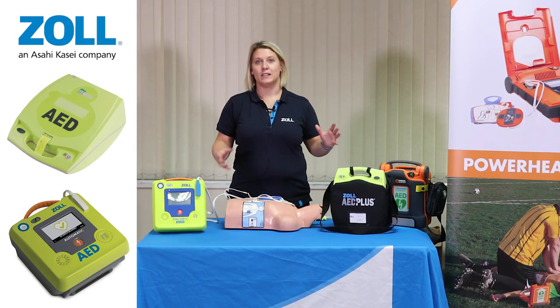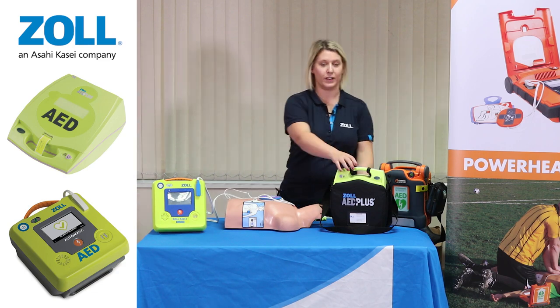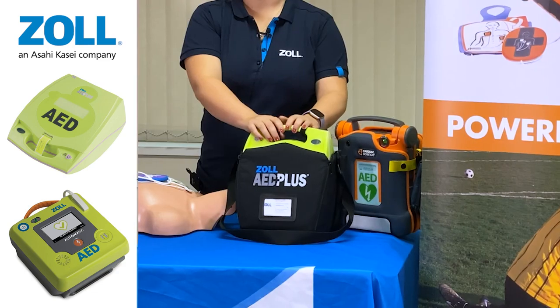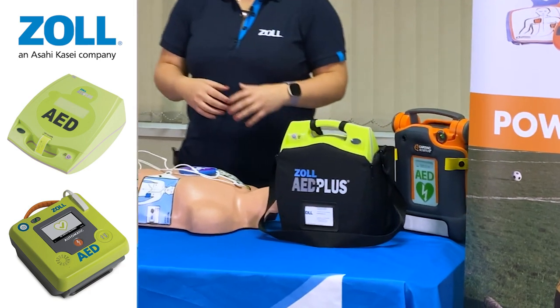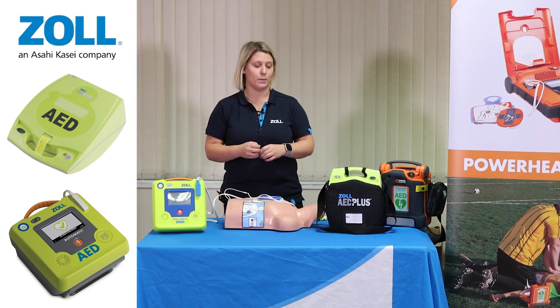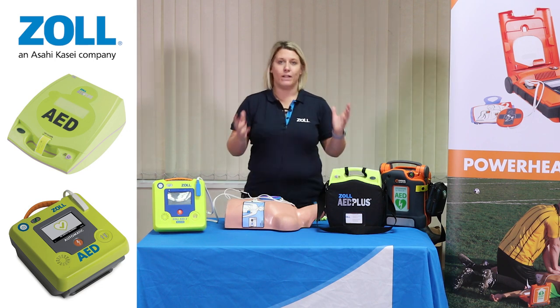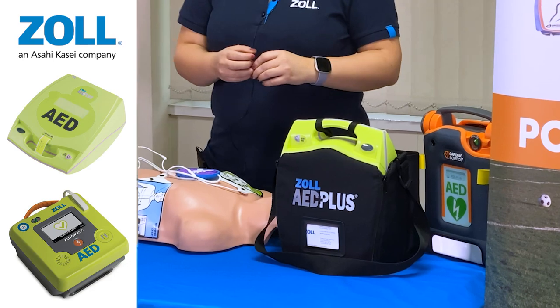In terms of what differentiates these devices, they can be used in lots of different environments. So for example, for the AED Plus, this is a great all-rounder device that will provide your lay responder with everything that they need to be able to respond in an emergency — an office environment, a beautician, whatever the environment, it will be suitable for all.